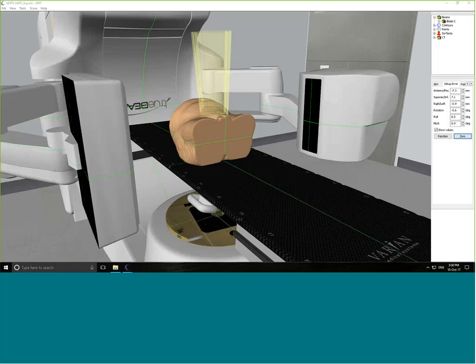Any thoughts or questions or anything you wanted to add, further to what you've seen? No, I think it's quite impressive. We're looking at it more as a teaching tool, as I think most people will be, for newly qualified staff. Which is why we were asking about importing our own cone beams that we do on a daily basis, which I think is coming in the next version. But certainly from a newly qualified radiologist's point of view, I think it's a useful tool to have, to be honest. Yeah, absolutely. Well, I hope so.